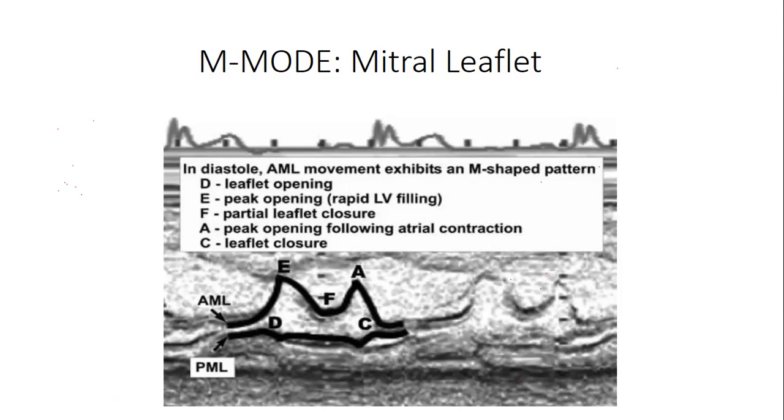One, the heart muscles have relaxed. What is happening within the heart? The left atrium is filling. The left ventricle is filling. What is happening and where are things happening? So this E is the early phase. I'll come and explain these things. It's unfortunate we won't do the physiology together because you need to do that part. If not, we have to do it as a discussion.